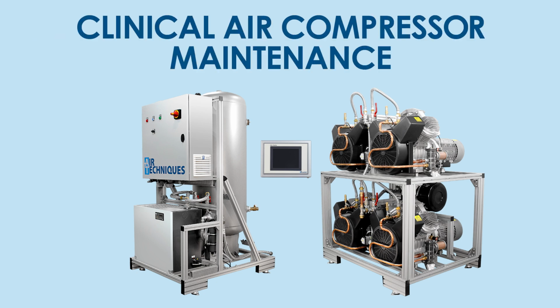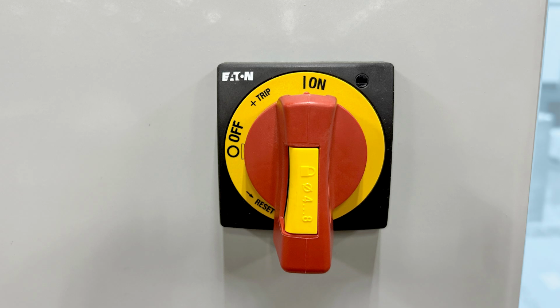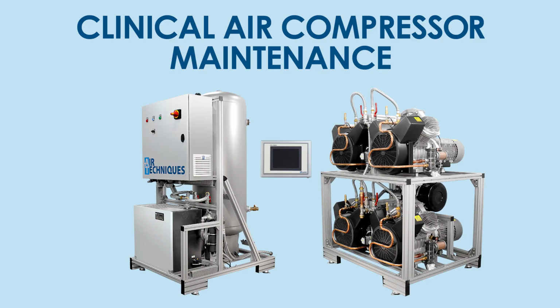Once all replacements are complete, power up the system and ensure everything is functioning properly. By following these steps to replace the muffler intake, you will ensure the efficiency and functionality of your system.